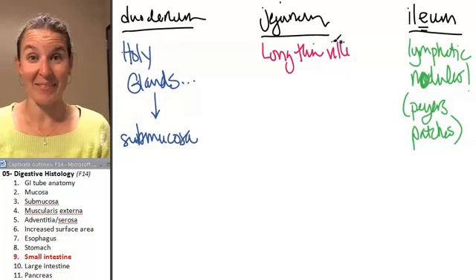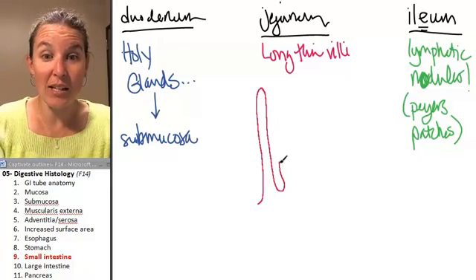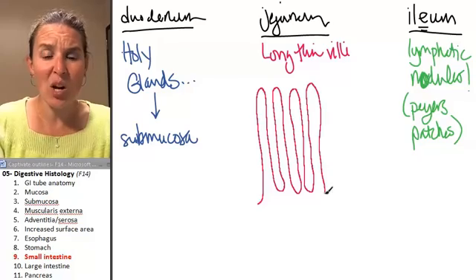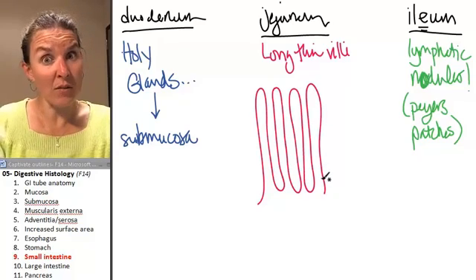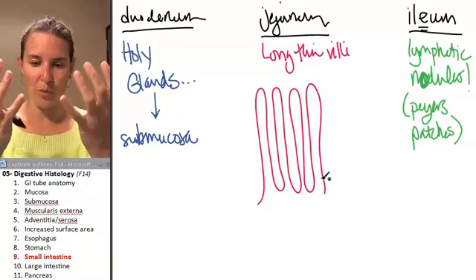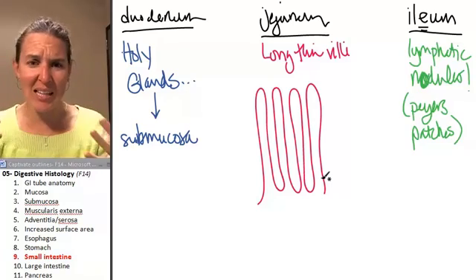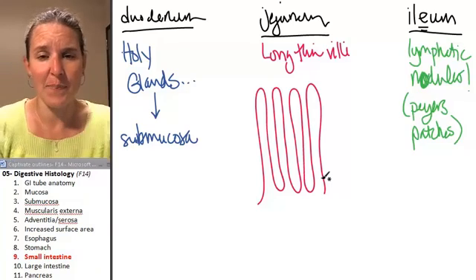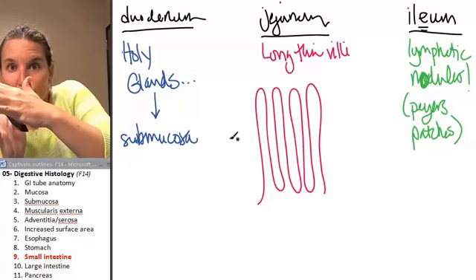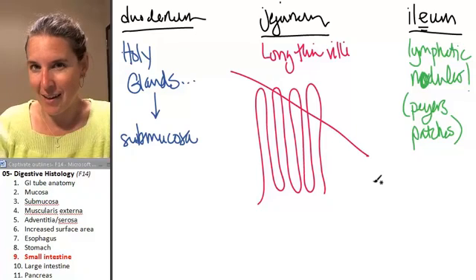All of them have villi. For whatever reason, the jejunum, and we can actually try and speculate on why that is the case, the jejunum has really, really lots and lots of long, thin ones. And something that happens, now imagine you have a tube, and in your tube it's lined with all these crazy long spaghetti-like tentacles, the villi. And then I take a section, and my villi kind of move over a little bit, and they smear, and I end up taking a section of villi like that.